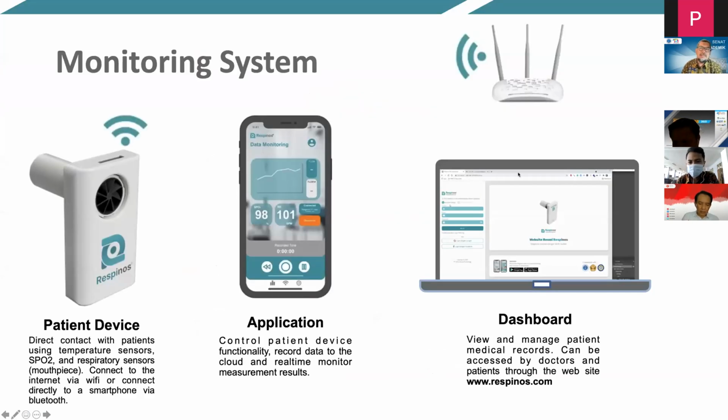And then this as a system, we can see it's like this. So this device is used by the patient. This device is in direct contact with the patient using a temperature sensor, SpO2, and a respiratory sensor using the mouthpiece here. And also it has Bluetooth and Wi-Fi connection. And for controlling this, we designed an Android application.